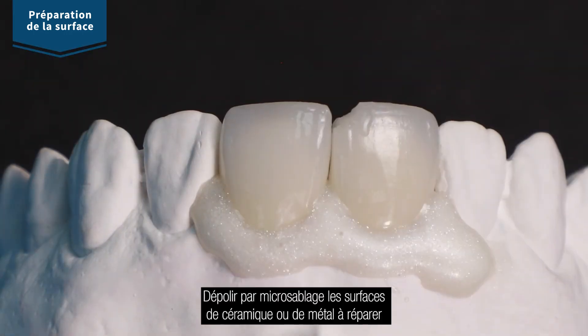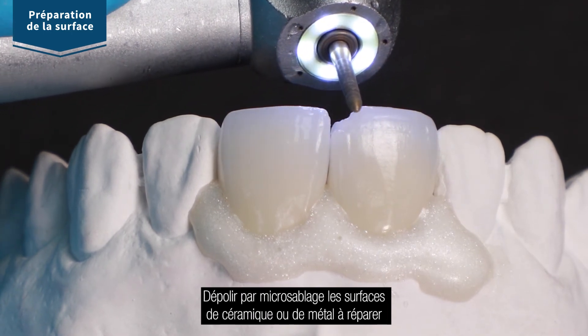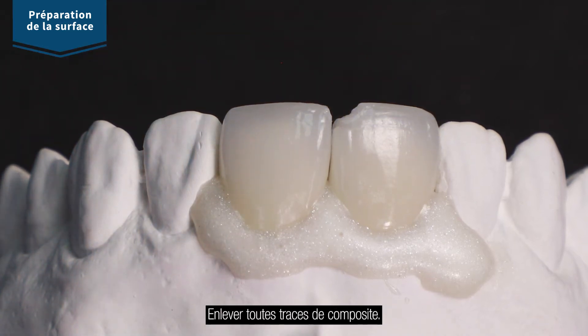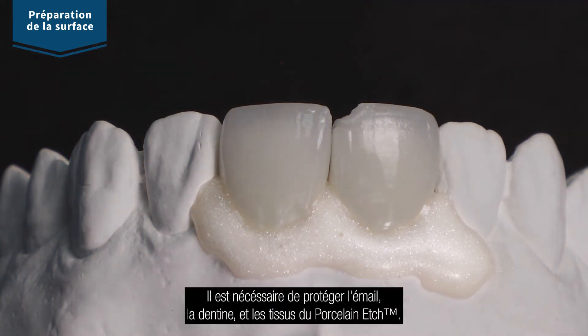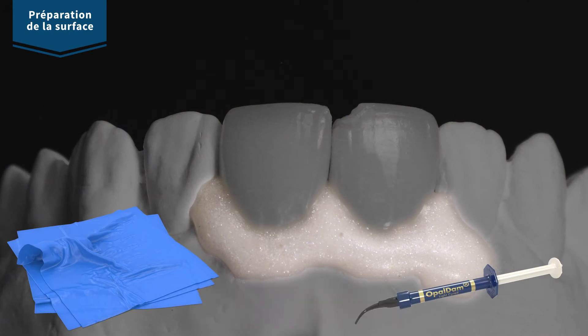Slightly abrade porcelain surface or exposed metal surface with a high speed diamond burr or micro air abrasion. Remove any composite if present. You must protect exposed enamel, dentin, and soft tissues from porcelain etch. Ensure proper isolation before continuing.